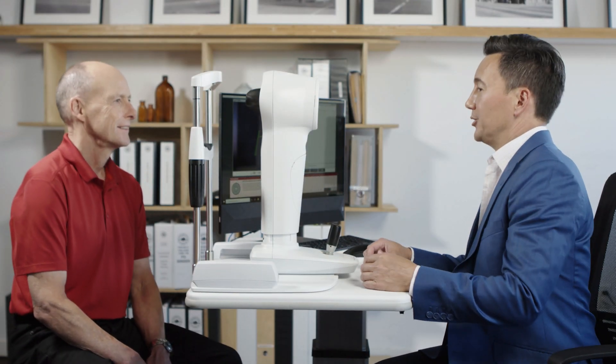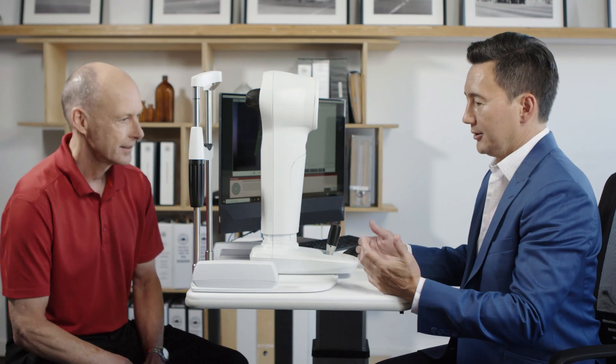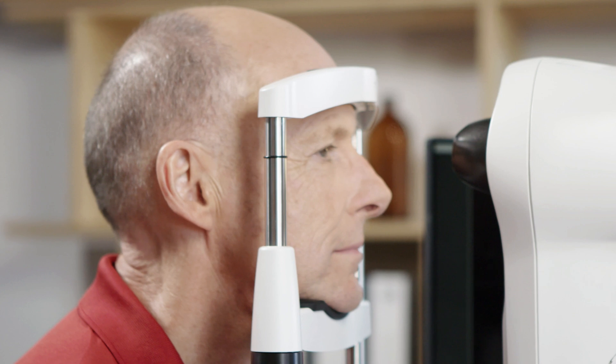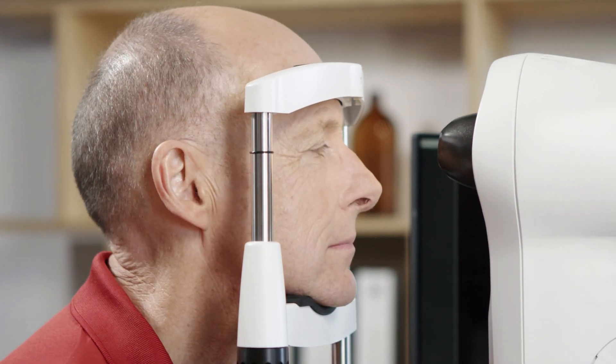One of the most important things that you need to do prior to taking a capture on a patient is make sure the patient is properly aligned. This is particularly important with small cone topographers.